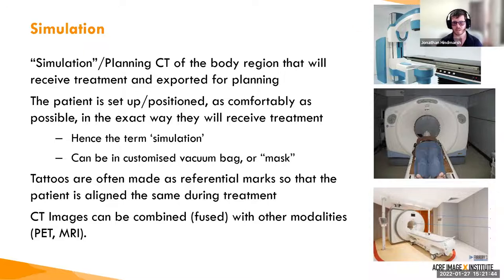So at the top here, this is an old style simulator. So it's a planar simulator. You would be very lucky to find or unlucky to find one of those in a department these days. More commonly, you'll find a CT scan, or you'll almost certainly find a CT scan in a radiation therapy department. And we're moving into the realm of MRI simulators because of their improved soft tissue imaging quality and the introduction of MR Linac. So a LINAC combined with a magnetic resonance imaging system.